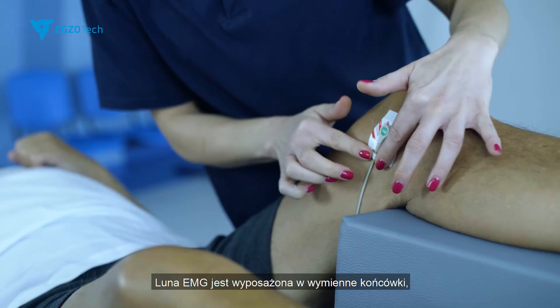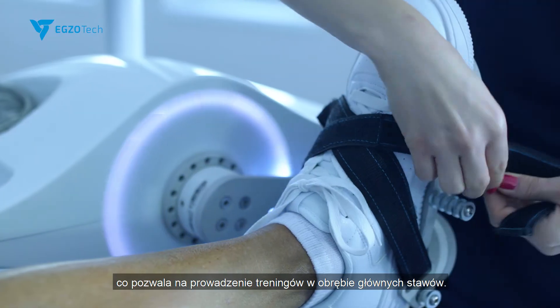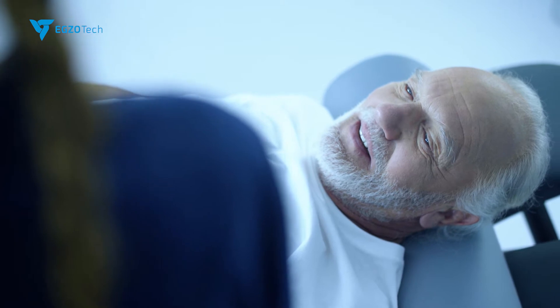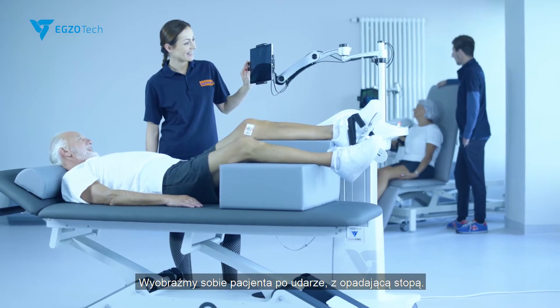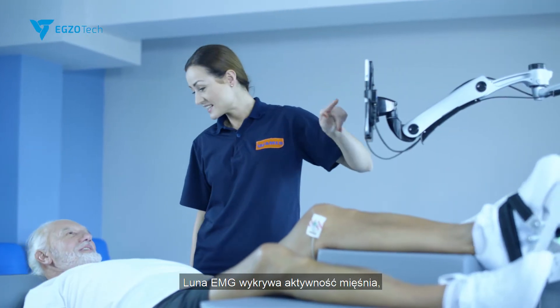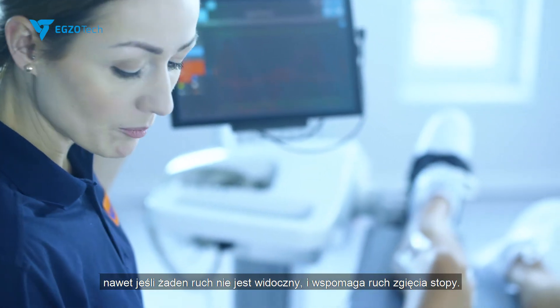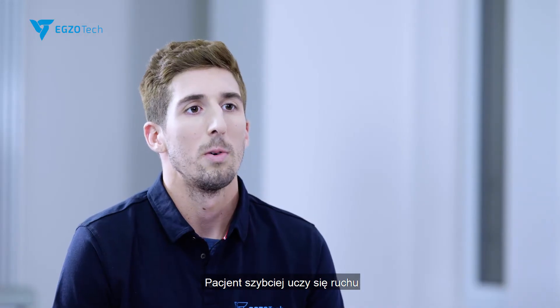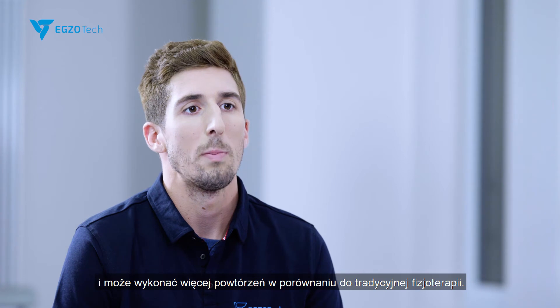Luna EMG is equipped with exchangeable extensions, which allows training of all major joints. Just imagine patients after a stroke with a foot drop — Luna EMG detects the activity of the muscle even if no movement is visible and assists with flexion of the foot. The patient is relearning the movement quicker and can perform more repetitions compared to the conventional therapy process.